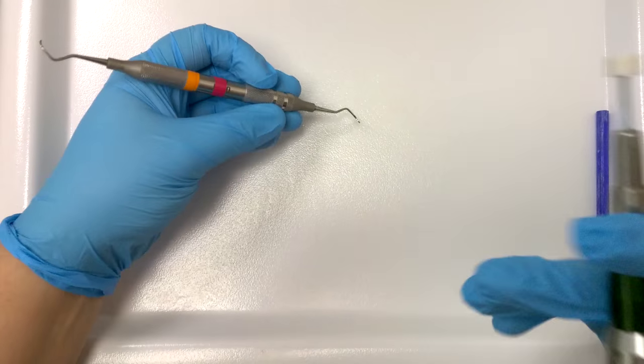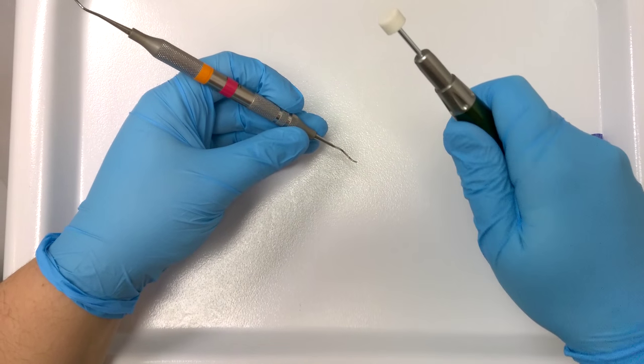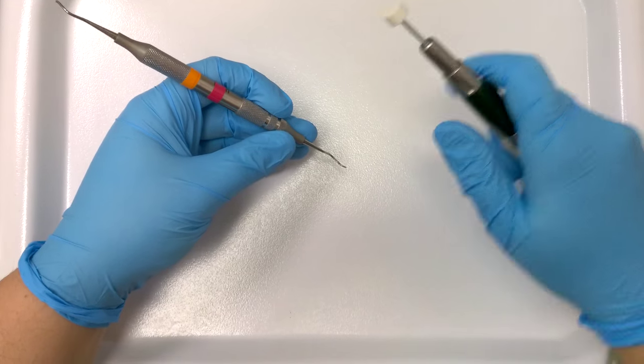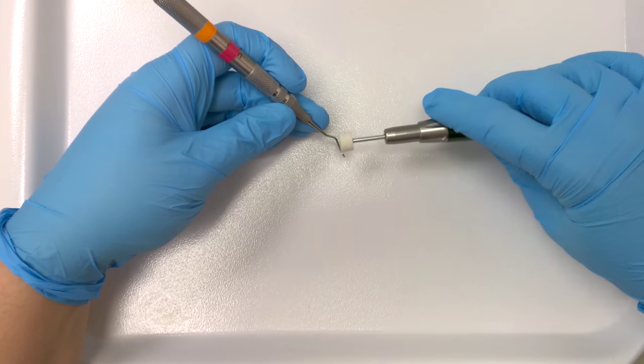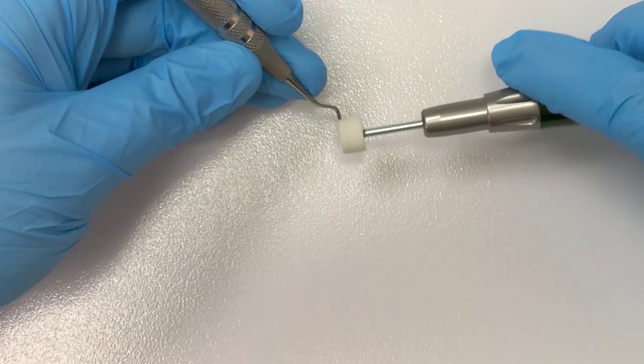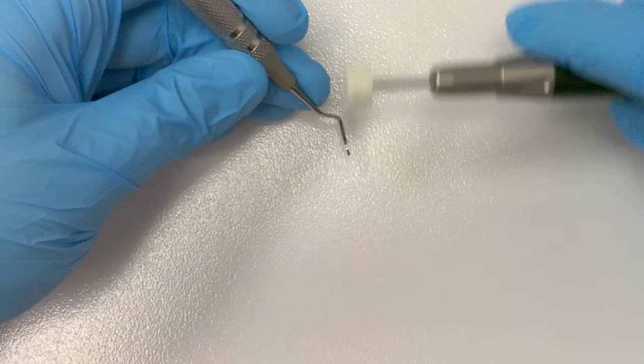So I'm going to hold the instrument in my non-dominant hand and I'm going to hold my handpiece in a grasp hold, low speed, the slowest you can. And you're just going to put pressure right on the face of your instrument.